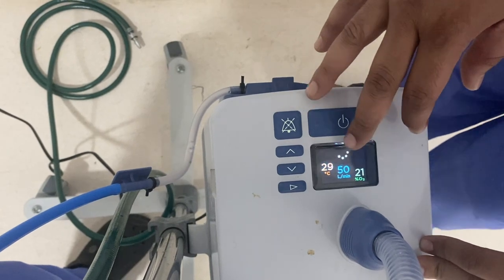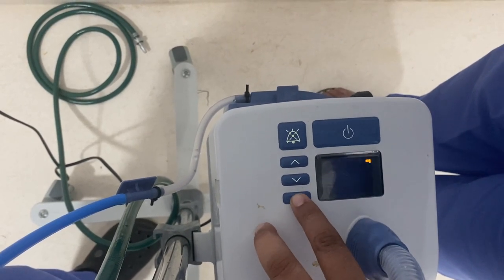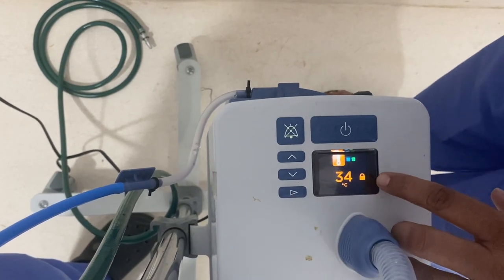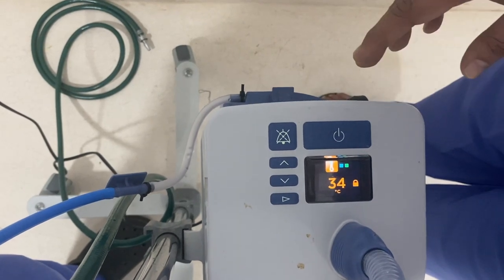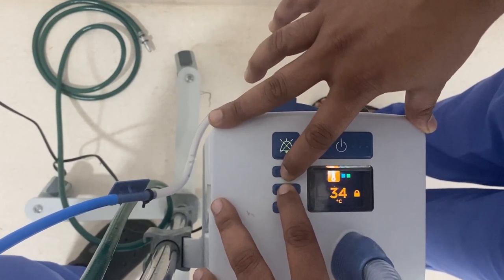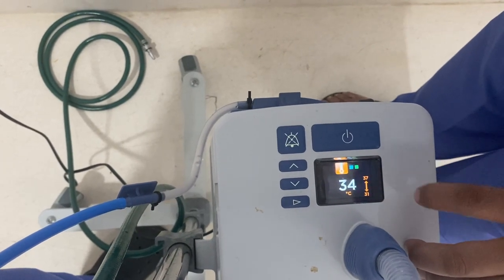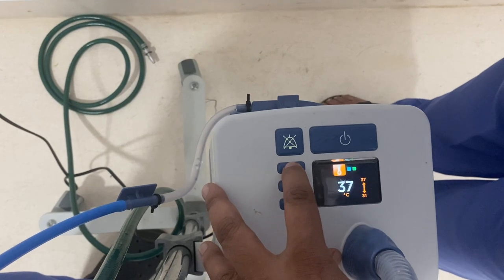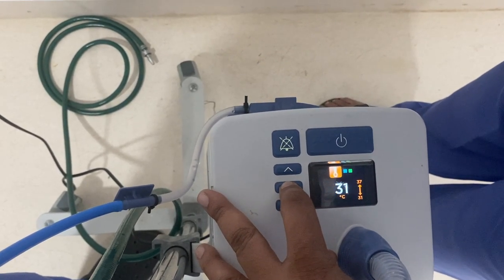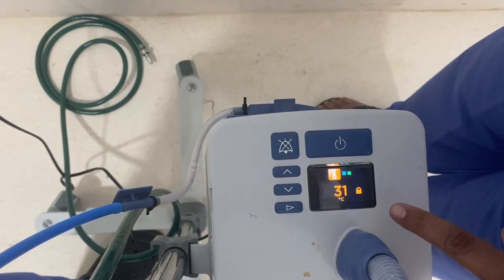We can change the first two parameters — temperature and flow — using the mode button. Once we press the mode button once, the temperature setting comes up. The setting is locked, so to change the temperature, we need to long press both the up and down buttons together for about 3 seconds until it starts blinking. We have a range of 31 to 37 degrees Celsius. We can set it to body temperature (37°C) or reduce it to 31°C if the patient finds the air too warm. Once selected, press the mode button again to lock it.